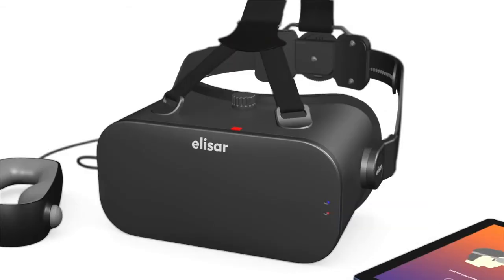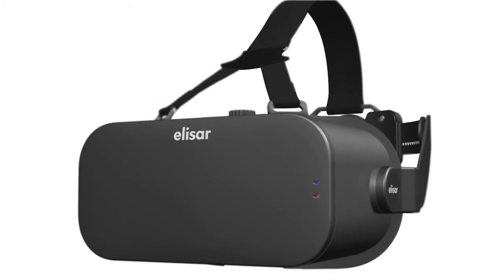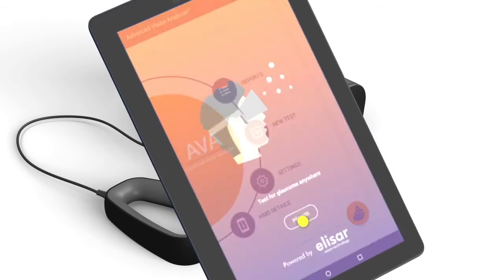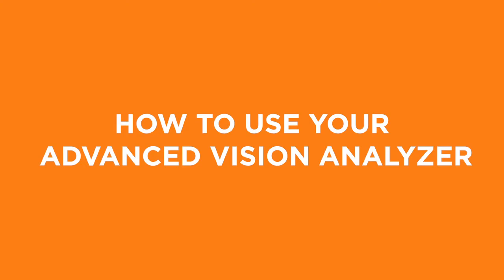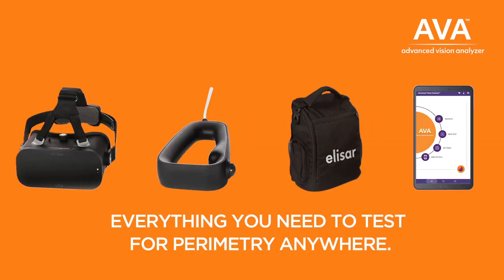The Advanced Vision Analyser, or AVA, is a wearable device that is intended for use as an automated perimeter to measure and characterize the visual field of a patient. In this video, we are going to walk through how to set up and use AVA. AVA provides everything you need to test for perimetry anywhere.